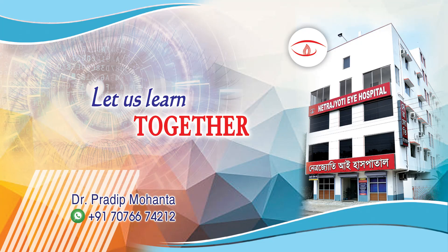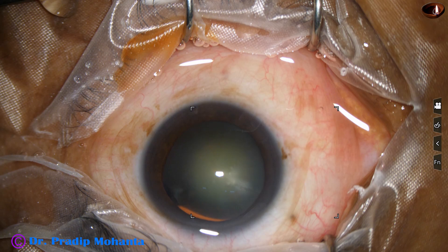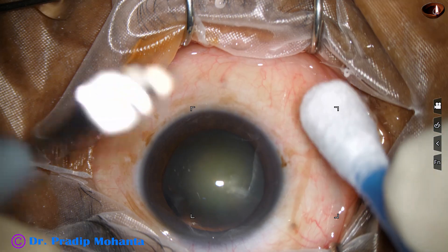Friends, welcome to my workplace for hands-on PHACO and SICS training. This is a cataract with grade 3 nuclear sclerosis. Let us see the management of this case.